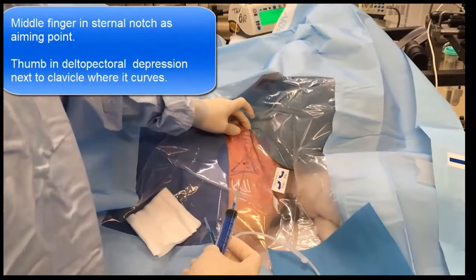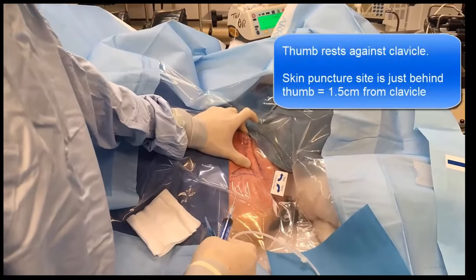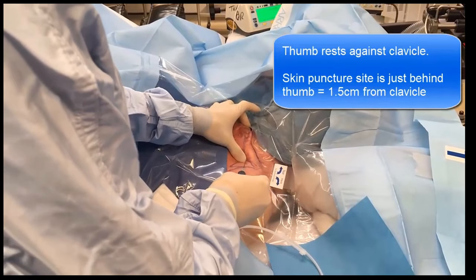Place your middle finger in the suprasternal notch and run your thumb along the clavicle to where it starts to curve, placing it into the hollow of the deltopectoral triangle, roughly at the junction of the lateral third and middle third of the clavicle. With the ball of your thumb resting against the inferior edge of the clavicle, the skin puncture point is just inferior and adjacent to your thumb, approximately one and a half to two centimeters away from the clavicle. In a conscious patient, infiltrate the skin and subcutaneous tissues all the way to the clavicle with local anesthetic.